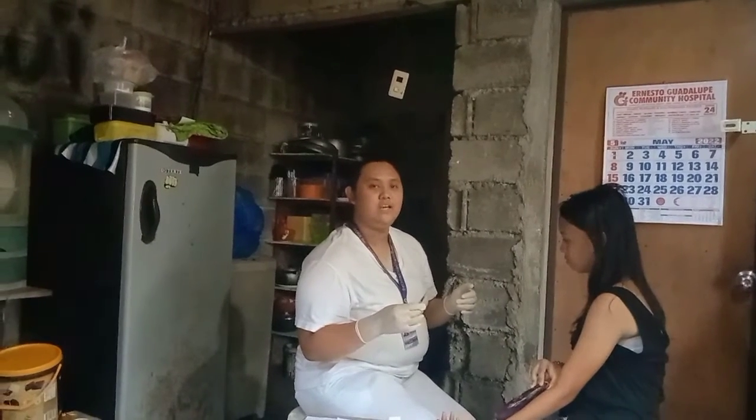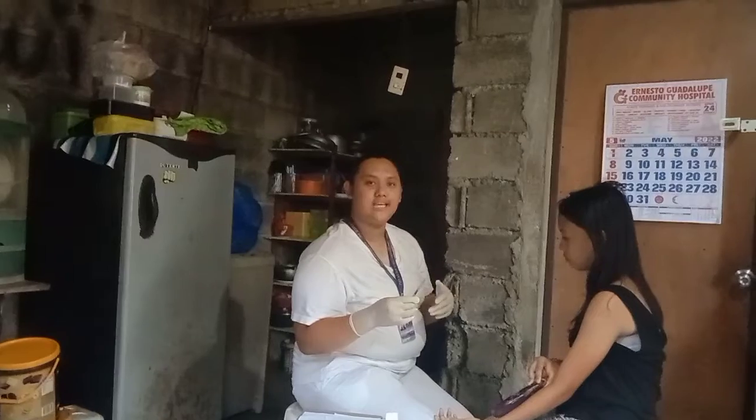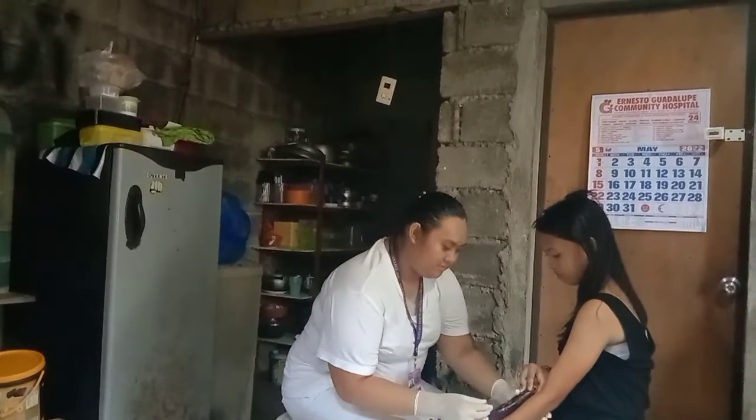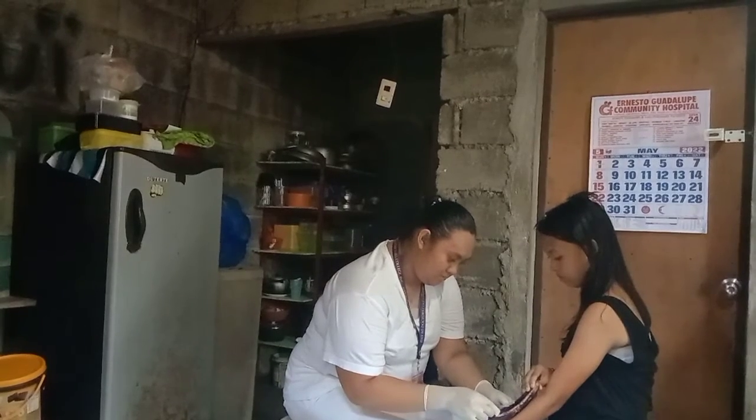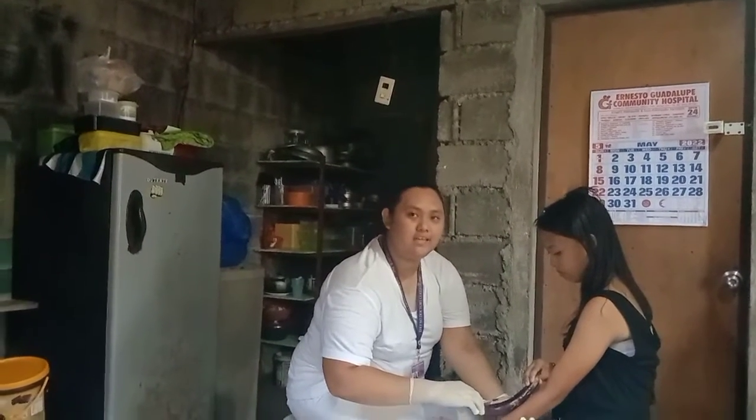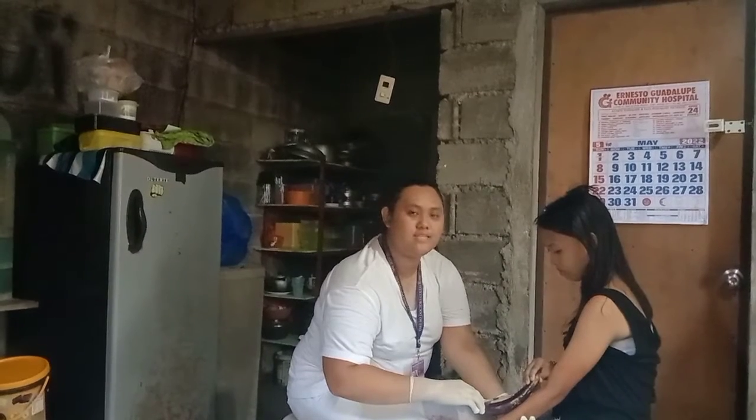Slowly inject the medication and feel the resistance until you see a bleb that resembles a mosquito bite appear on the patient's skin. Slow injection minimizes discomfort at the site. The dermal layer is tight and does not expand easily when you inject solutions. Withdraw the needle at the same angle as when inserted and pat dry with a cotton ball. Do not massage the area.